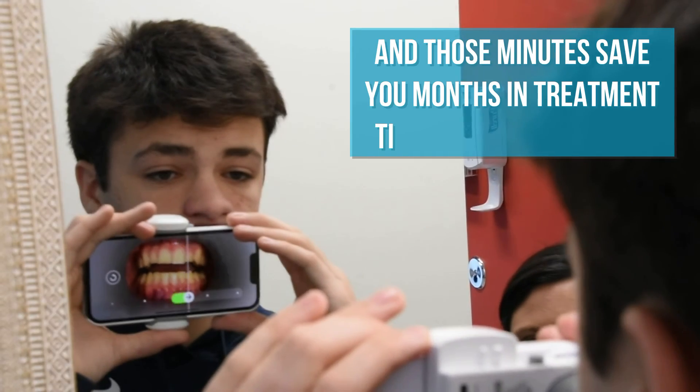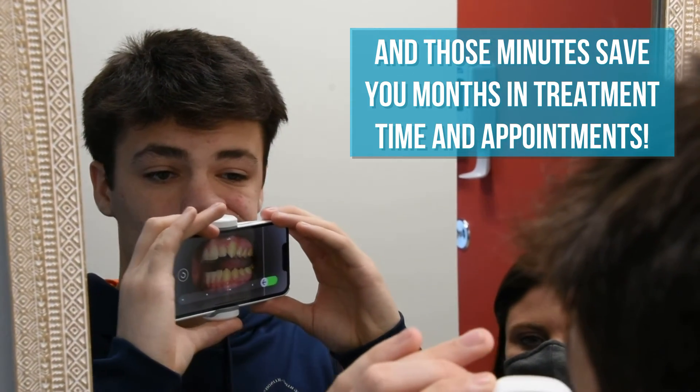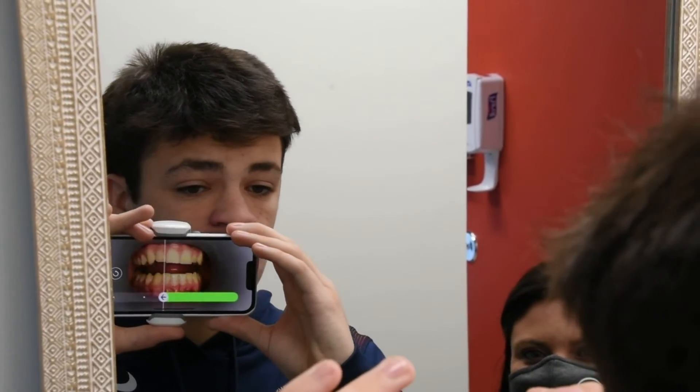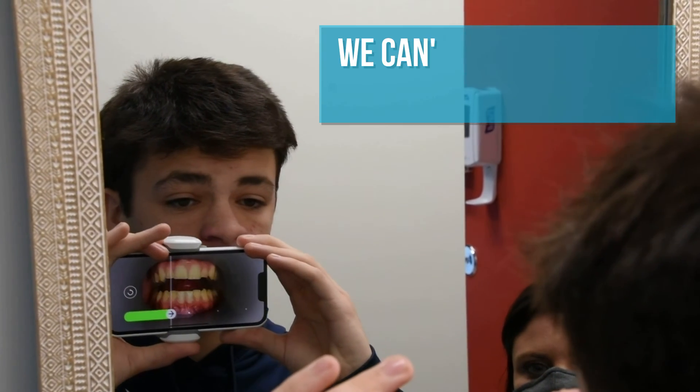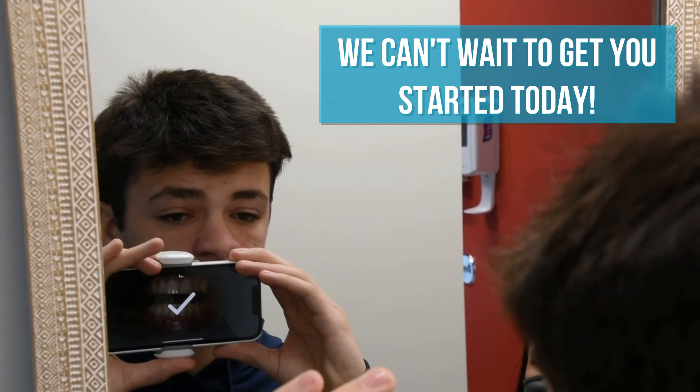Shift the scan box to one side, then shift the scan box to the other side. Back to the center. We're done. Perfect. You can now remove your cheek retractor.